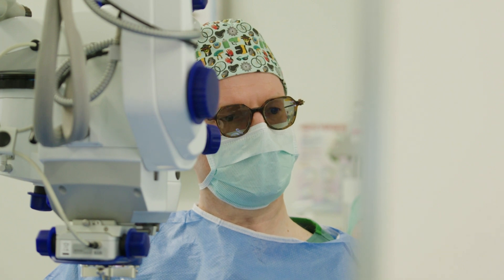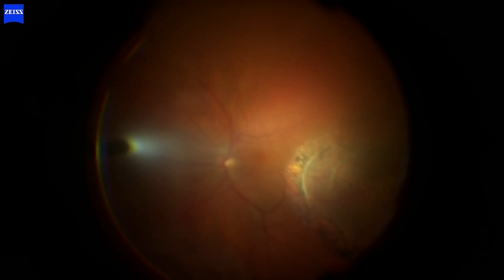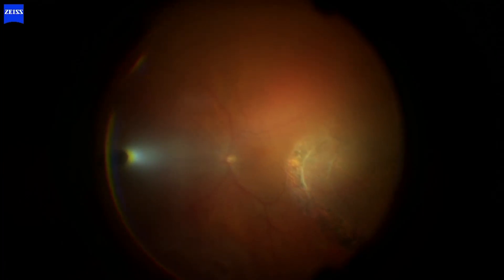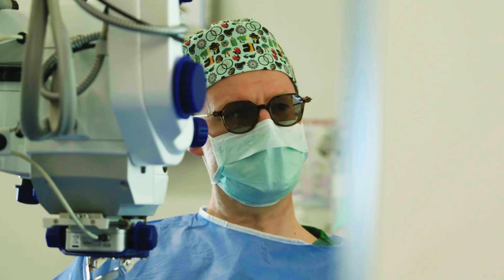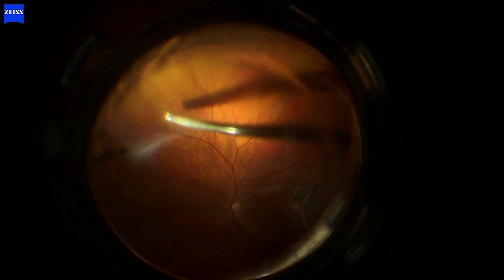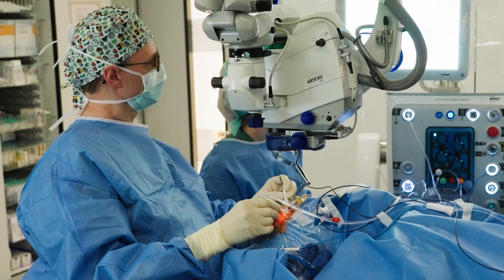For retinal surgery it is important to have a view up to the ora. That is sometimes difficult to achieve without indentation of the eye. This is the image quality we get with the 128 diopter reusable lens, which has been processed a few times — it's made out of glass, so we have some condensation. Now I will switch to the new ultrawide disposable lens. The image quality difference is striking and there's no condensation. We have an extremely good view of the eye — here I see the ora, the infusion cannula entering the eye, and I can even see the ciliary body. You see all structures in the eye with no need to indent.